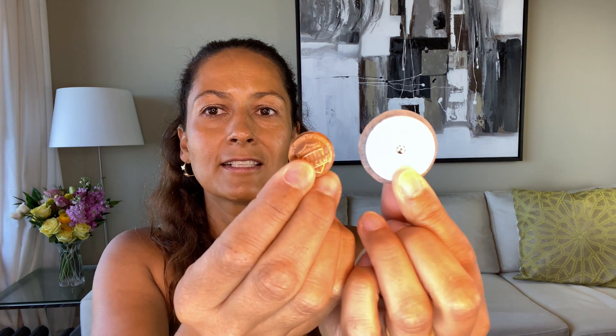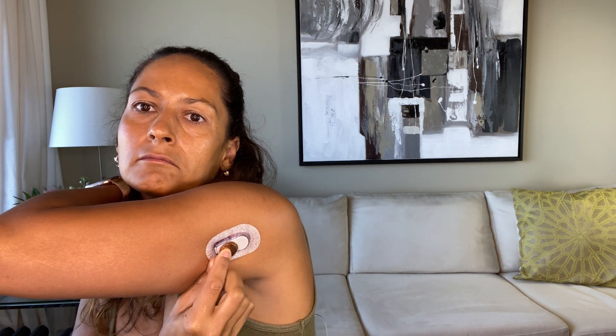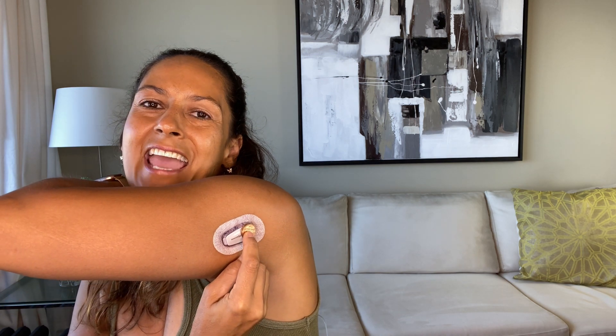First of all, the Libre 3 is way smaller than the other sensors. This is a Libre 2 or Libre 14 Days, and the Libre 3 is about the size of two stacked US pennies. Here are two US pennies so you can see the size difference — this is major. I'm also showing you the thickness. I'm also wearing a Dexcom G6 on my upper arm right now, and you can see the two pennies correspond basically to the end of the sensor. Tiny compared to the 14 Day and the Libre 2.